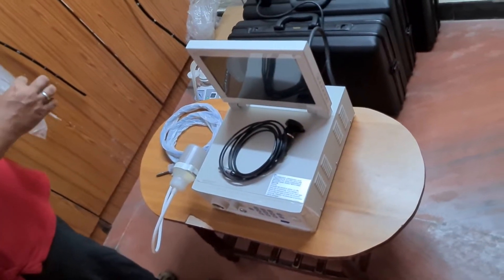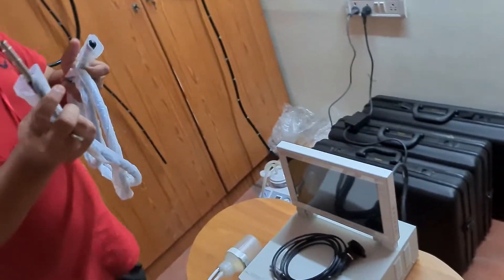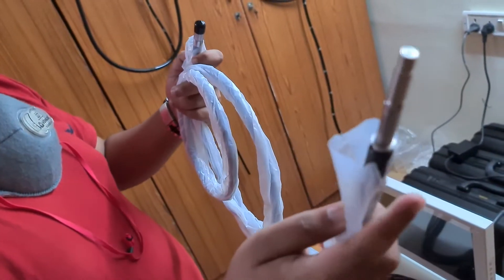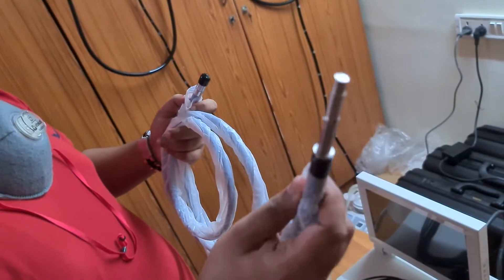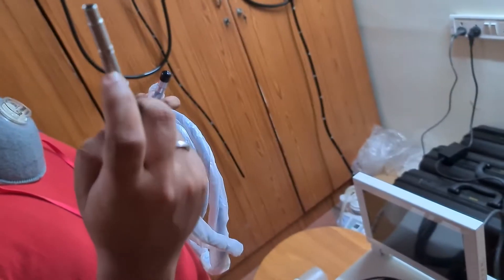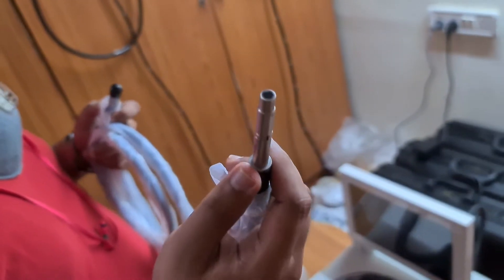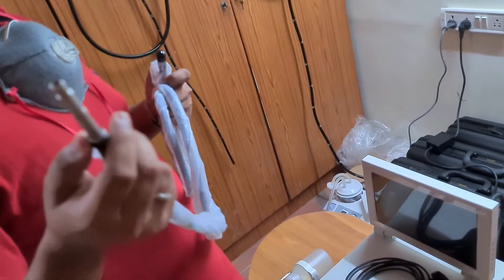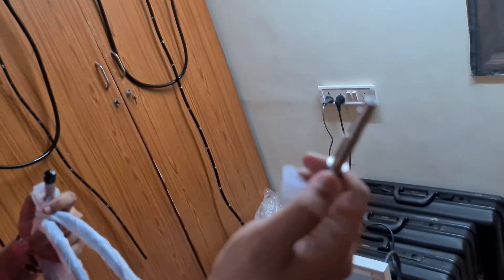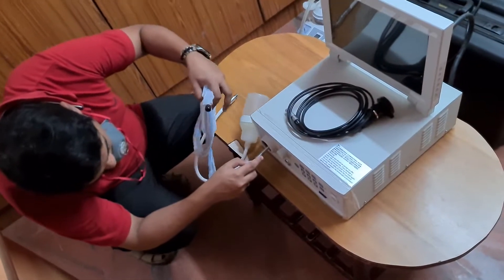Whenever you are handling the light guide, be very extra cautious — even if you drop it once, the light bundle is not going to work. This needs to be handled very carefully. As I mentioned in the previous video, the longer tip is used for the light guide and the smaller tip is used for the air-water feeder pump. For laparoscopy, you won't need suction or air-water feeder, so we are going to attach this into the light source of our processor. Be very careful — it will go in only one direction.